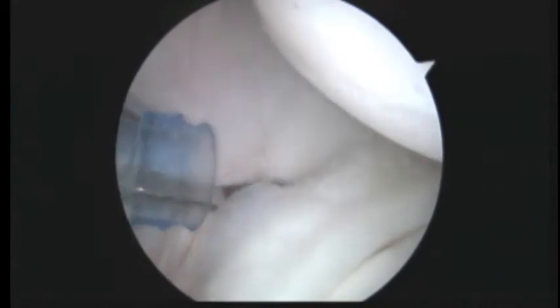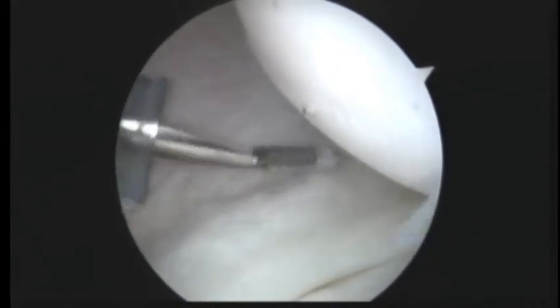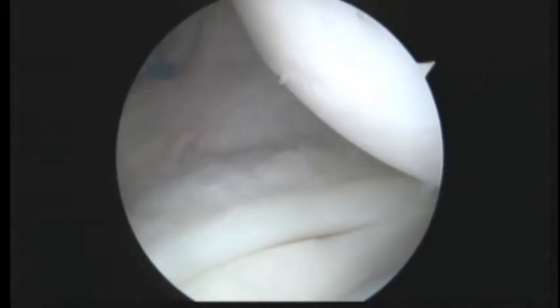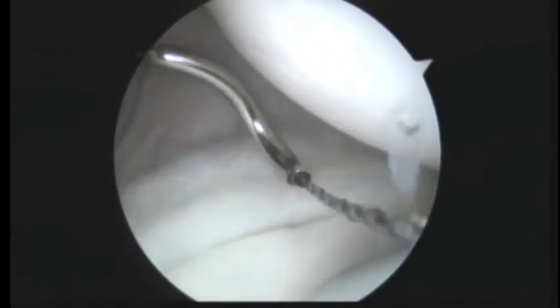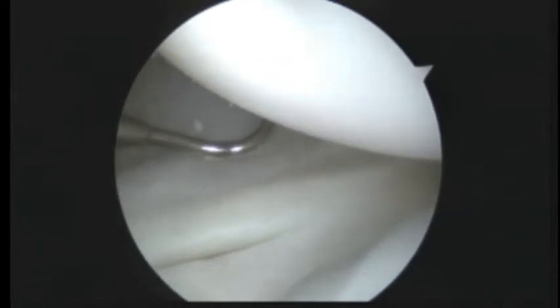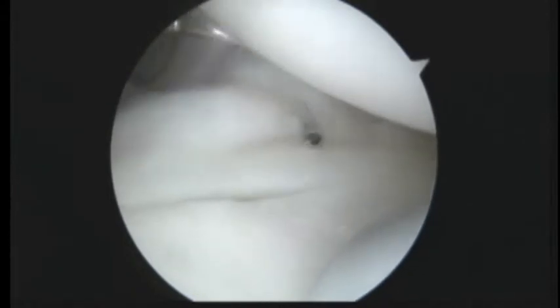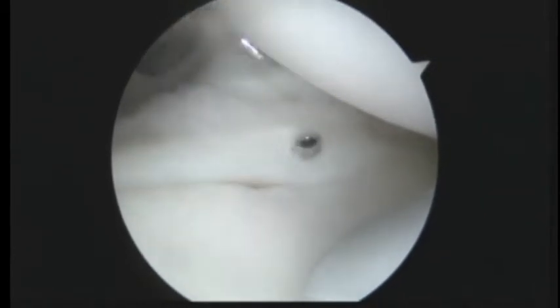And then the main instrument that we're going to be using to pass our sutures is called the suture hook. Here's the hook. It's what we call a turn to the right hook. It's loaded with a black wire that you see there called a super shuttle. And we're going to start down low, right about here. So we get a bite of this posterior capsule here. Then we'll come back and come underneath the labrum. There.